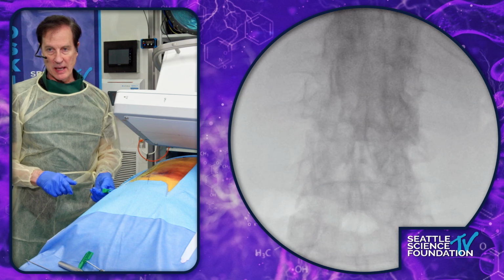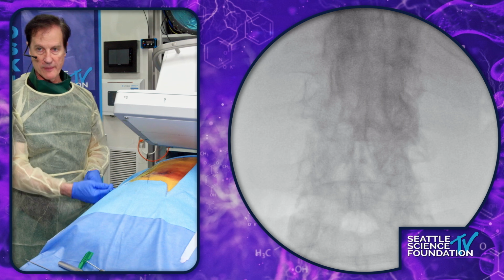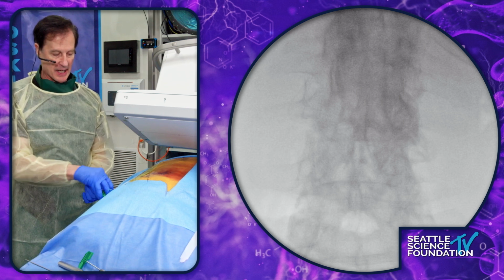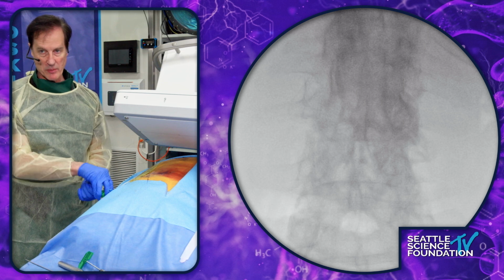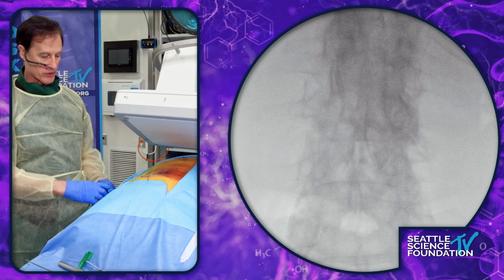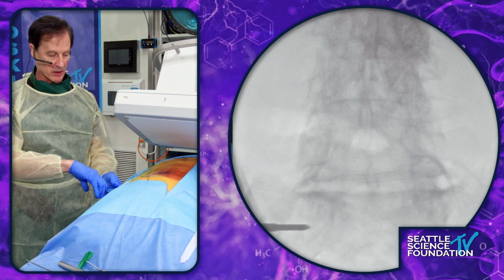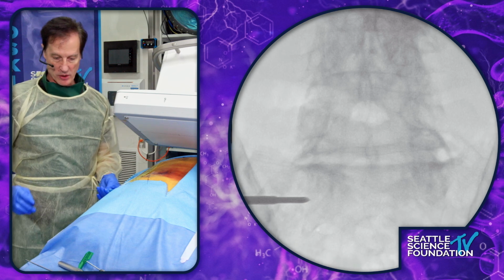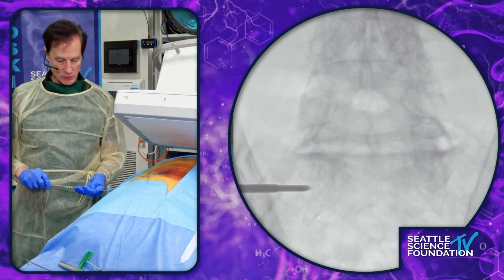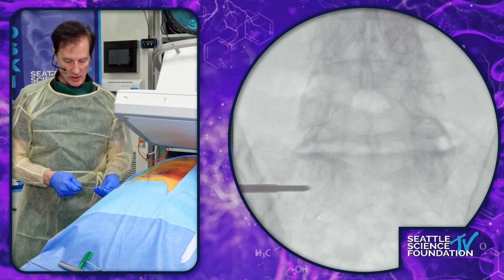And this is about the depth that we'll put the screw, at about the 11 o'clock position relative to the S1 neural foramina. So I'm going to take our rigid access out. And keep in mind, this is a bony corridor. We're not too far anteriorly. We're not violating anything in the pelvis, including the lumbosacral trunk. We're not too far posteriorly, getting into the spinal canal. We have that wide swath of territory that we're going through that is the S1 bone corridor. So I can actually come out on the other side and not hurt anything.